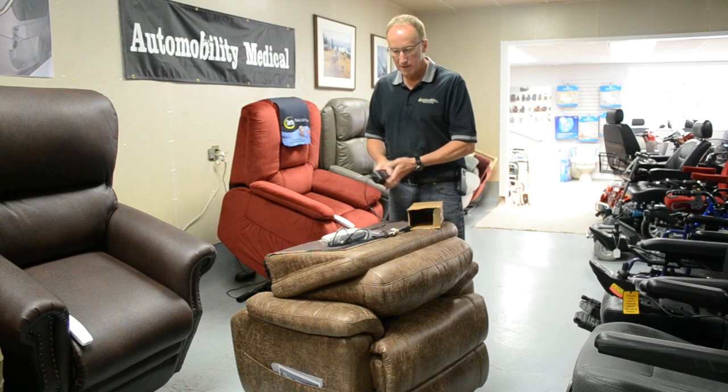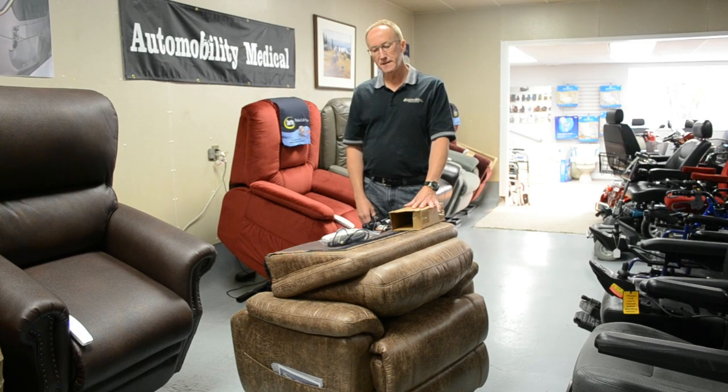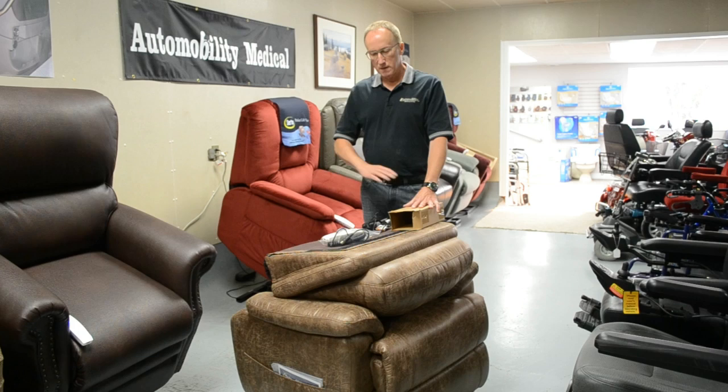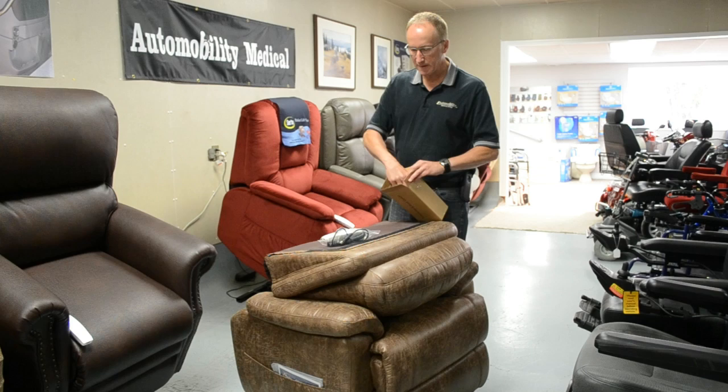It should come with your backup batteries — just those two nine-volt batteries you put in there. What that does is it automatically goes to battery backup in the event of a power failure, so you don't have to do anything. It does it automatically — it'll switch over to the batteries and let you get to a position where you can get out of the chair in case you were reclined. After the power comes back on again, you don't have to do anything — it switches back to electricity from the wall.